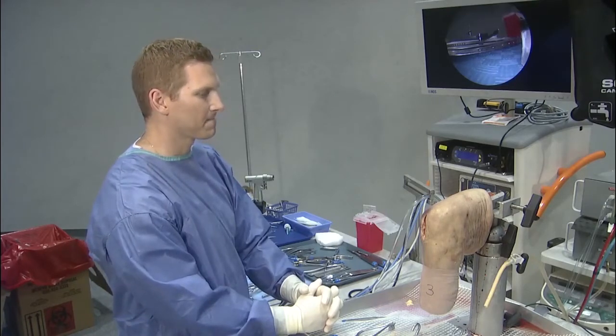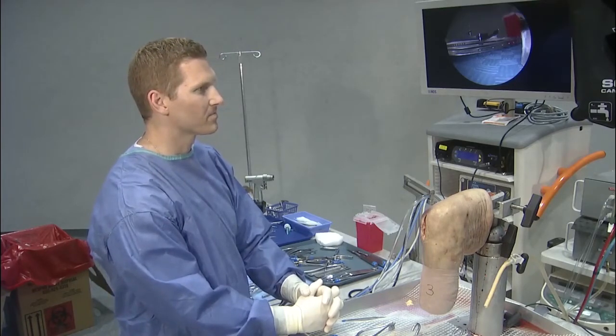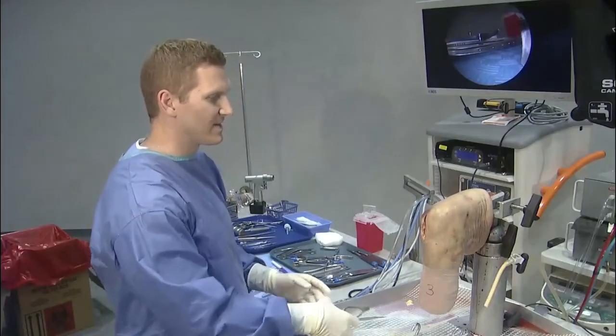Yeah, and I think that some people are still concerned about uncontained defects, and it just depends on where they're located and really what the mode of uncontainment is, if it's something you can improve at the time of implantation. But you really just want to make sure it's not something that's going to dislodge your graft, most importantly. Yeah. So we should probably get started here at the knee.